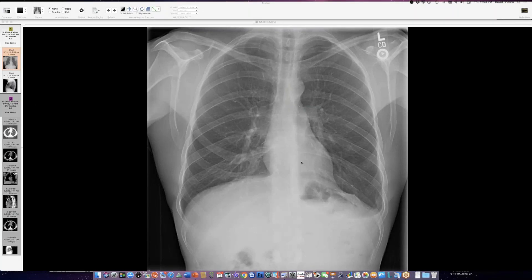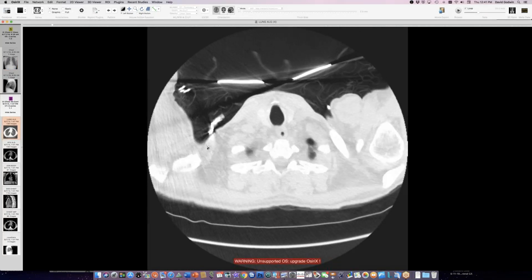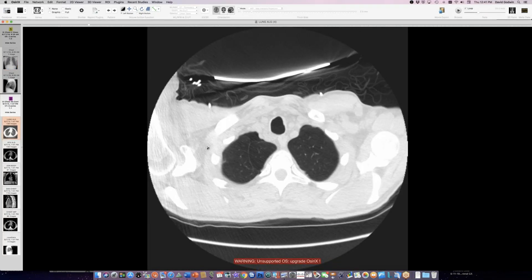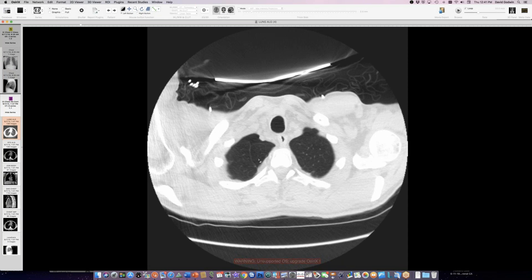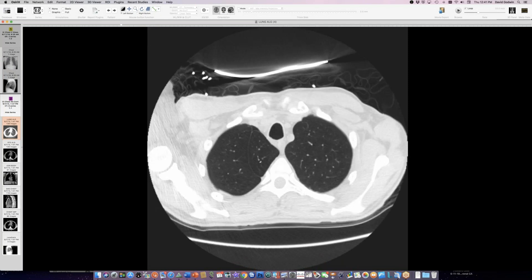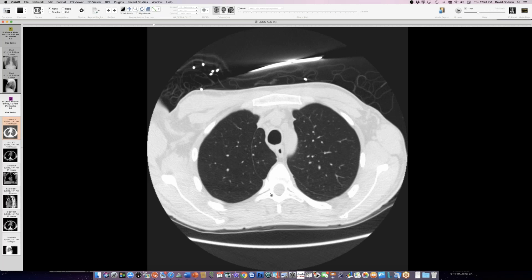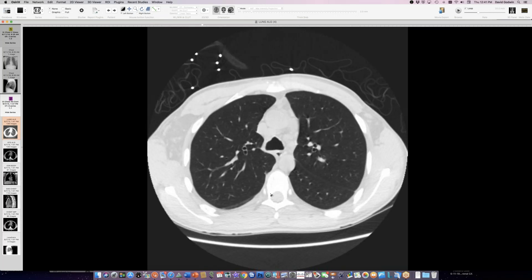A nice case of an azygous fissure here, but you don't see the vein in it on the chest radiograph. On CT, there's a pneumothorax and the azygous fissure is present but empty — no azygous vein in it.